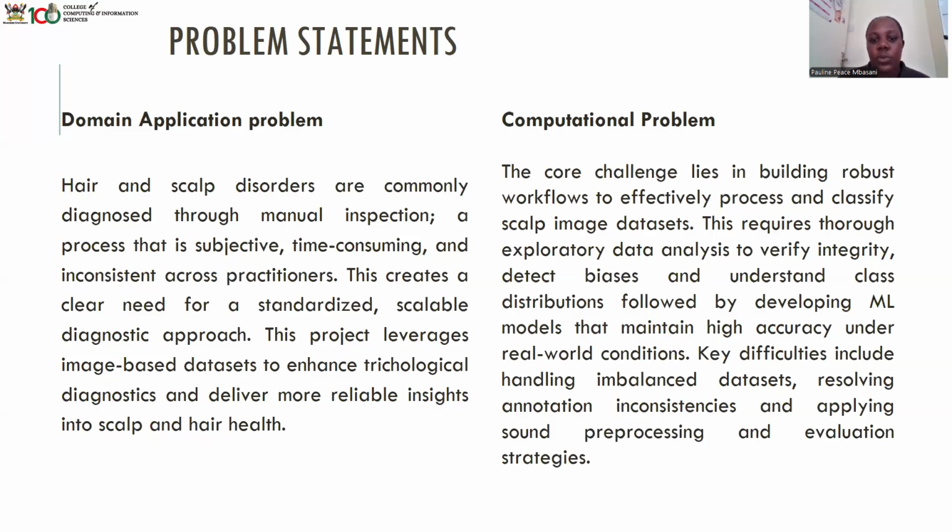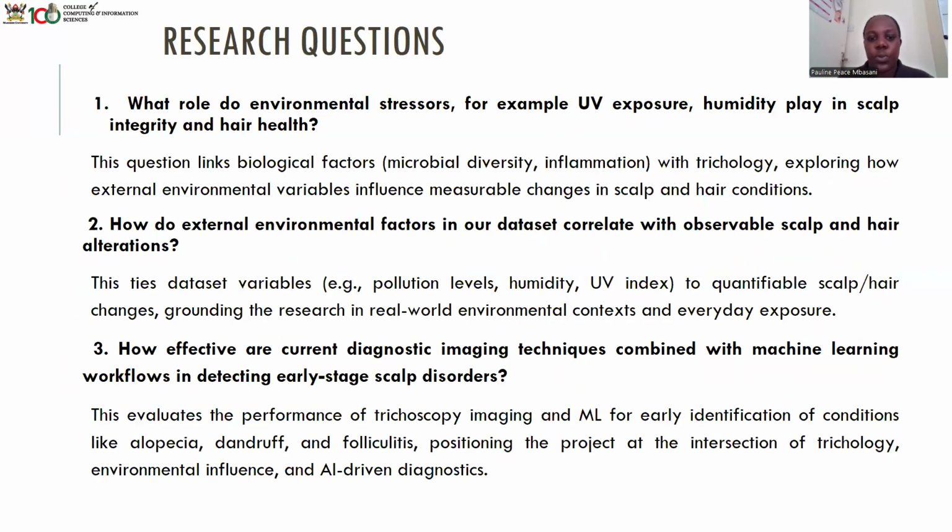Then for the computational problem, building robust machine learning workflows requires thorough EDA to detect biases and imbalances, which is followed by models that maintain accuracy under real-world conditions. So these models that you're training are going to work under different conditions. We need to ensure that even under these different conditions, the models are still accurate and are performing what they're expected to do. So that's for the computational problem.